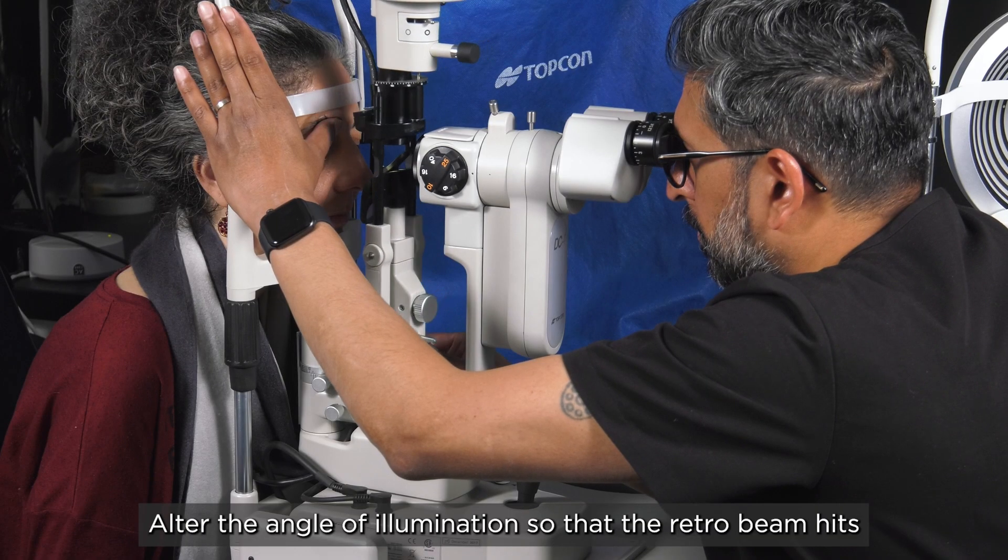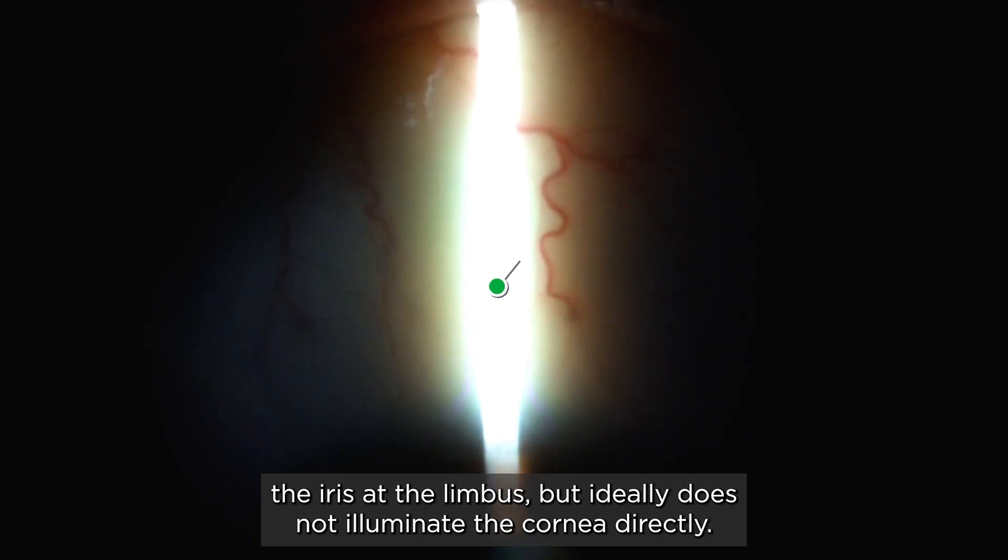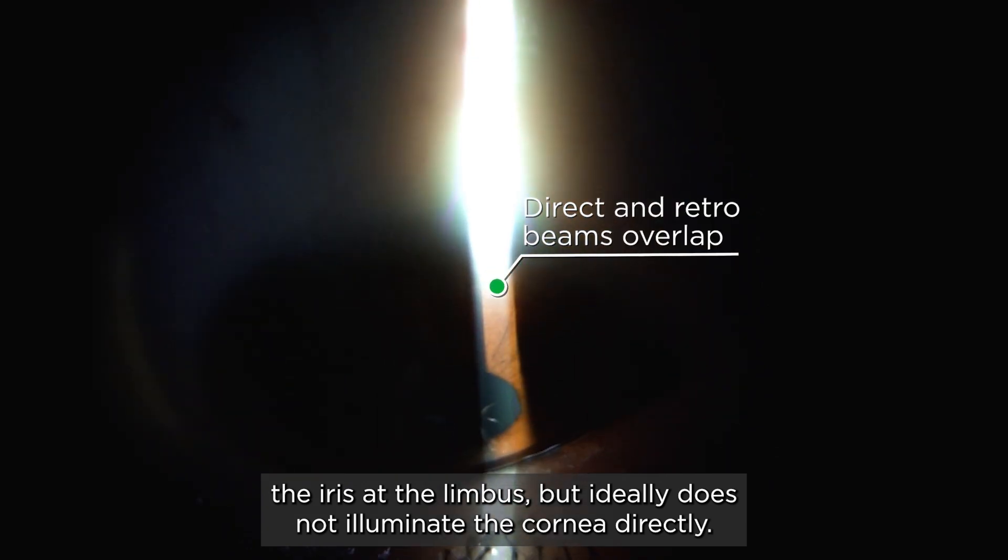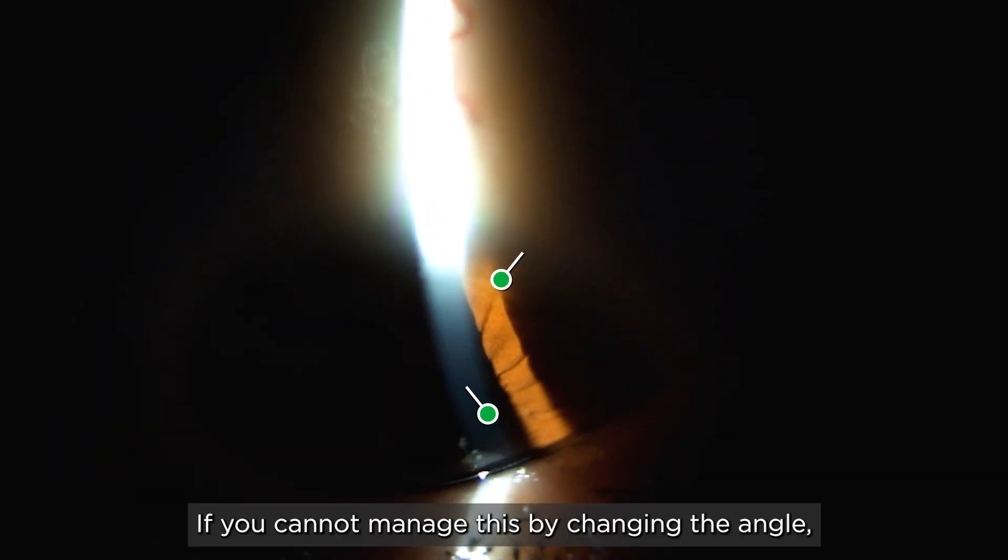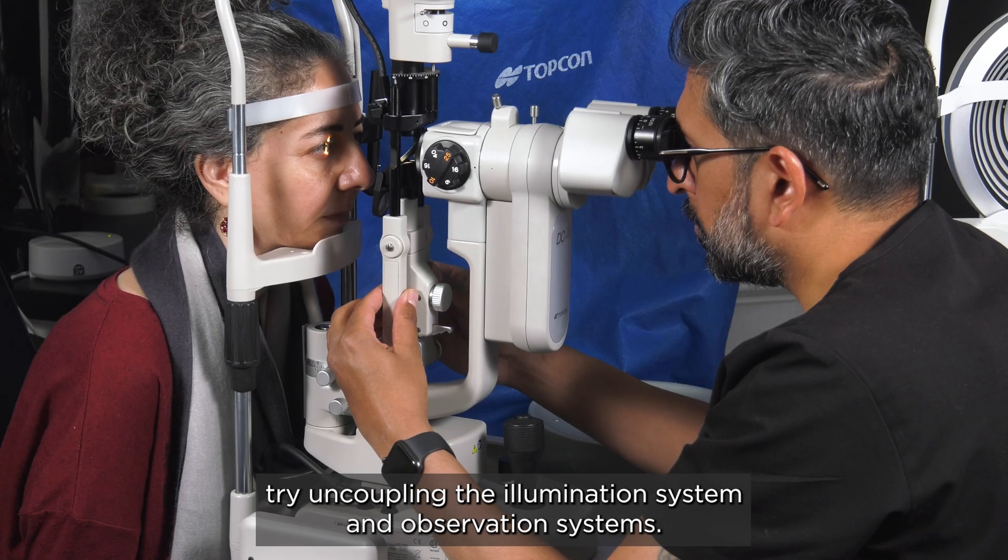Alter the angle of illumination so that the retro beam hits the iris at the limbus but ideally does not illuminate the cornea directly. If you cannot manage this by changing the angle try uncoupling the illumination system and observation systems.